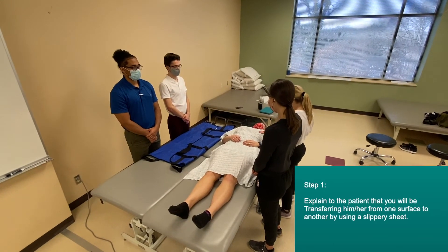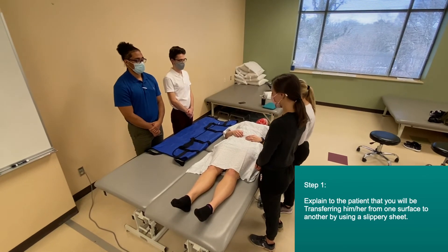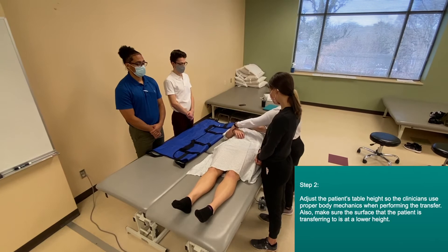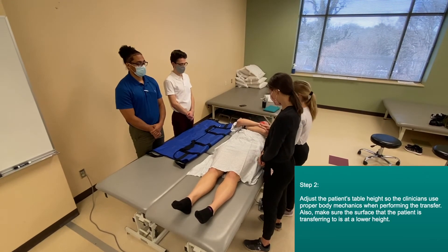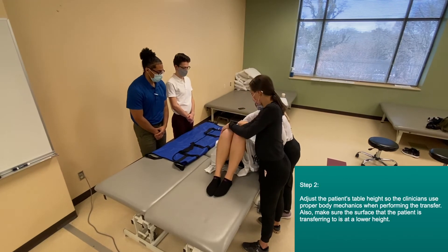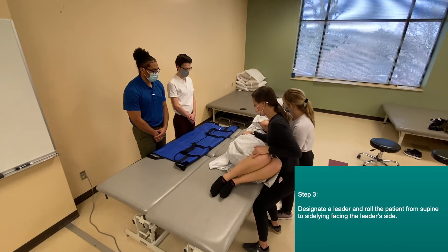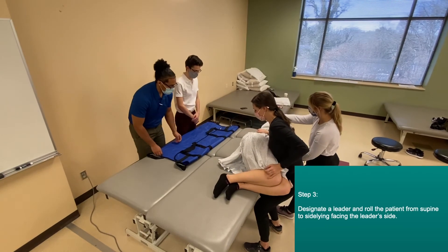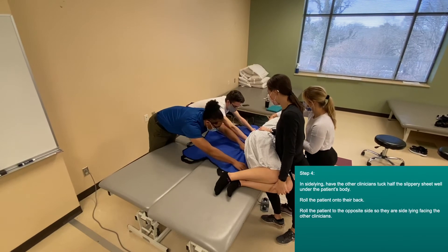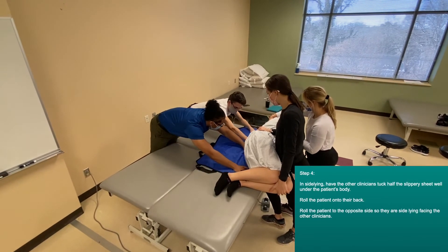Explain to the patient that you will be transferring him or her from one surface to another by using a slippery sheet. Adjust the patient's table height so the clinicians use proper body mechanics when performing the transfer. Also make sure the surface that the patient is transferring to is at a lower height. Designate a leader for the transfer. Roll the patient from supine to side lying facing the leader side. In side lying, have the other clinicians tuck half the slippery sheet well underneath the patient's body.